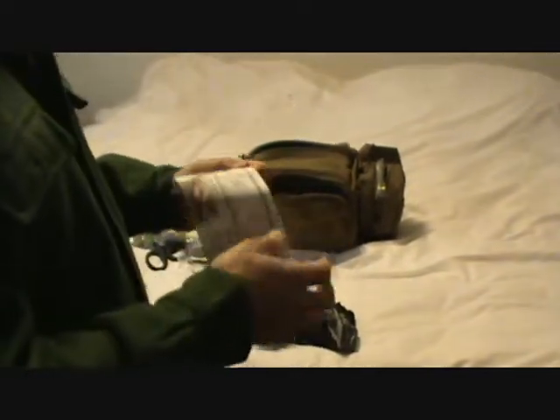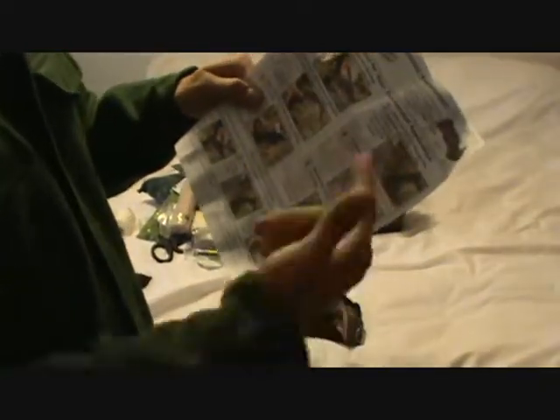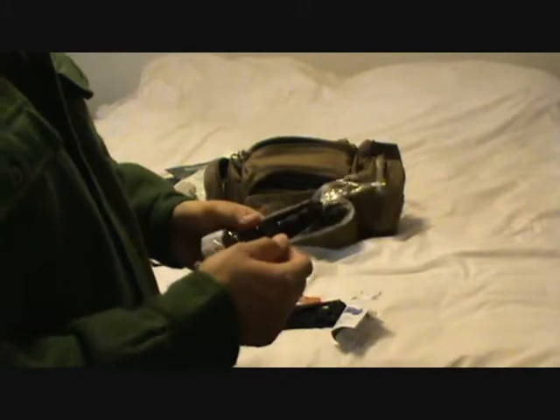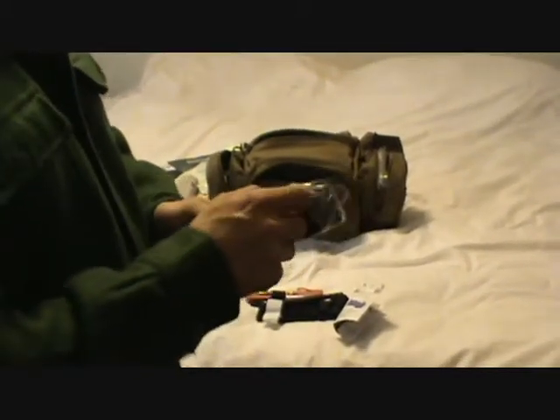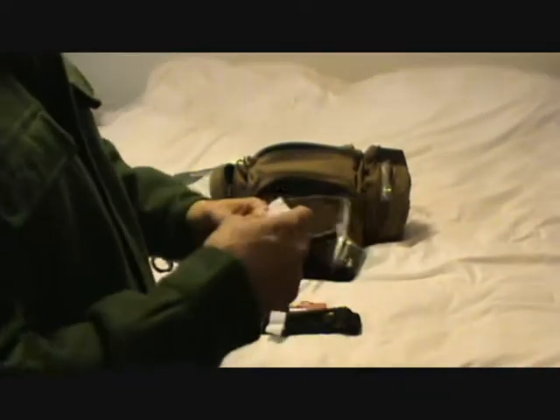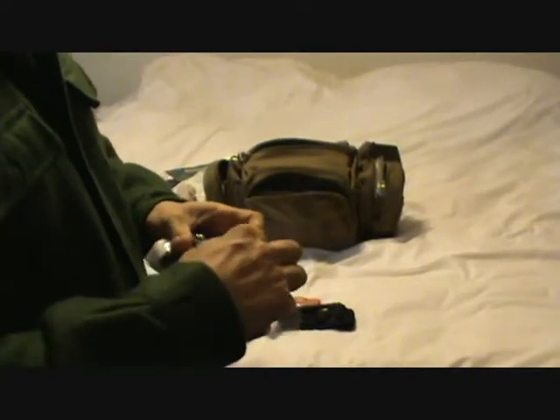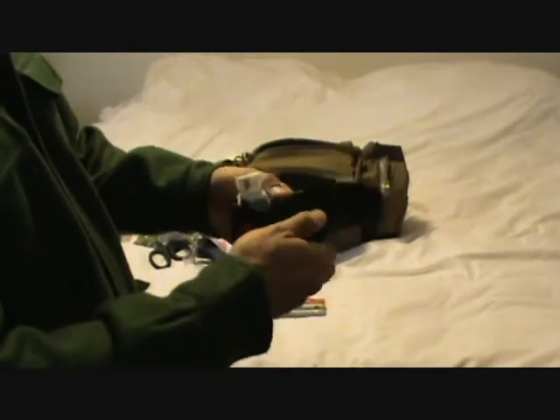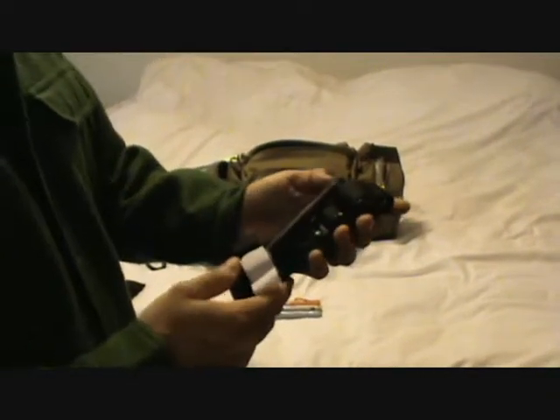Also carry right here a tourniquet. Comes with directions on how to use it. You get these offline. I don't think they run very expensive or anything like that. I do have a couple of them in the bags like this still. I would suggest that if you have several, keep some in the bags, and then take the rest, maybe 2 or 3, out of the bag, because if you do have to use these kind of things, you do just want to be able to rip into it and get it. I carry quite a few of these in my bag actually, tourniquets. Like I said, if you do get it, rip it out, read the instructions, know how to do it, practice.